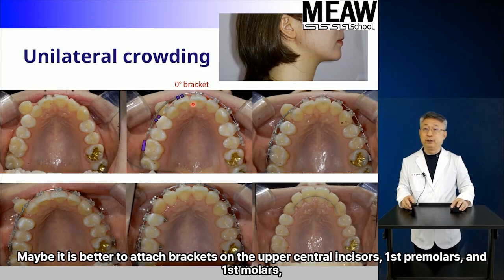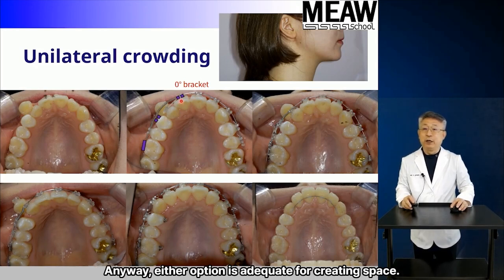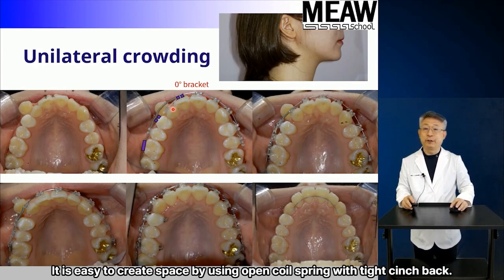Maybe it is better to attach brackets on the upper central incisors, first premolars, and first molars, because the upper midline, which is deviated to the right, should first be treated. Anyway, either option is adequate for creating space. It is easy to create space by using open coil spring with tight cinch back.